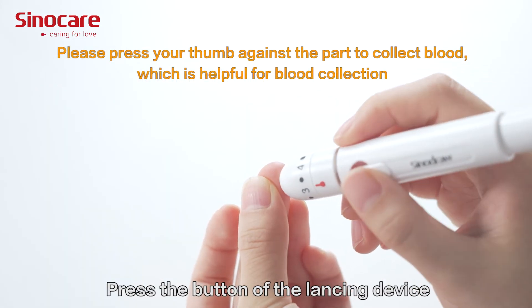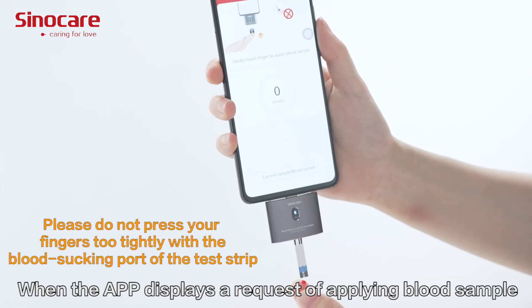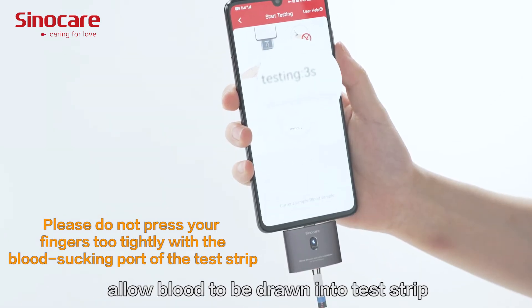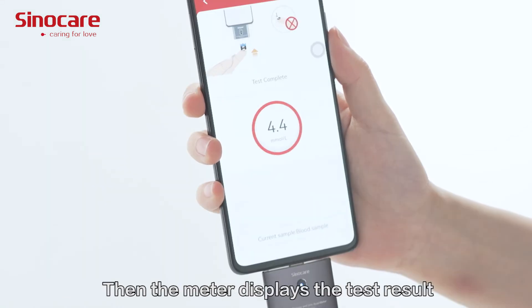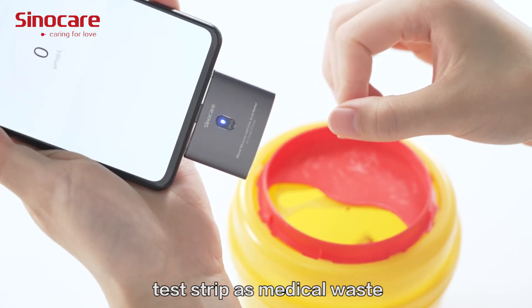Press the button on the lancing device. When the app displays a request to apply a blood sample, touch the sample tip to the blood drop and allow blood to be drawn into the test strip. Remove the test strip from the drop immediately once the meter enters the countdown from 5 to 1. The meter then displays the test results.